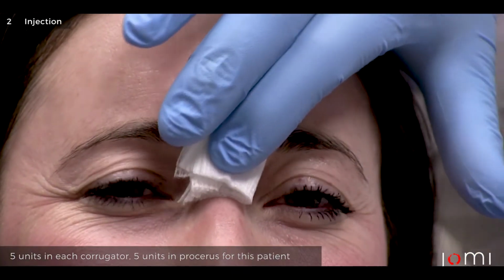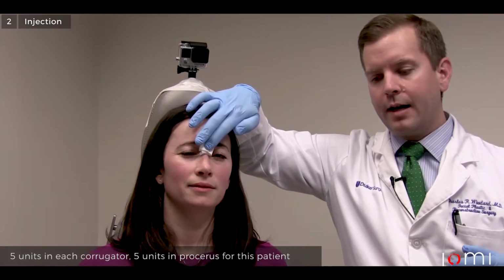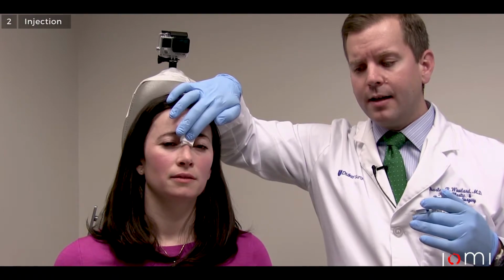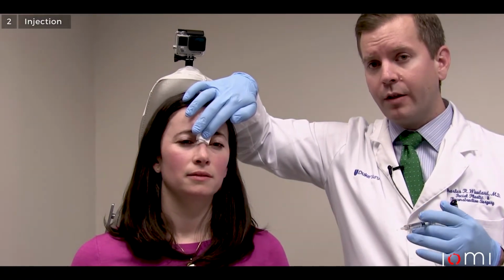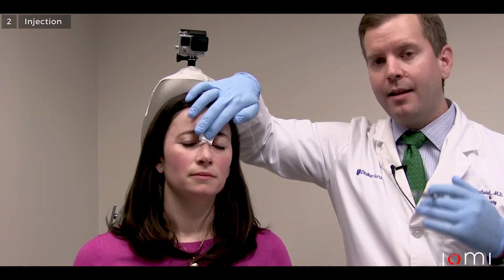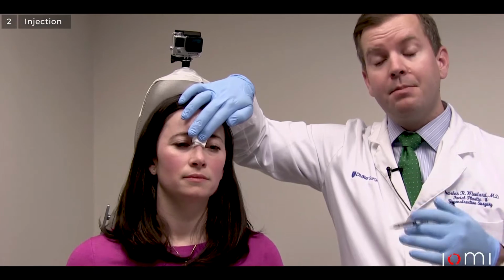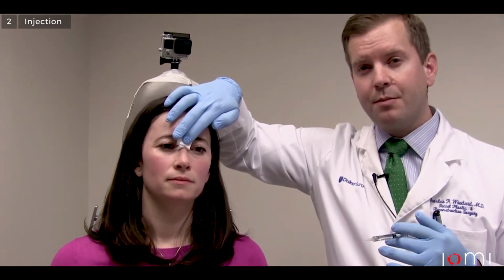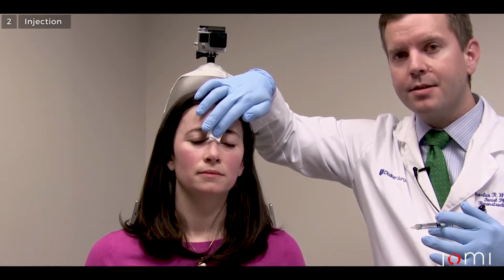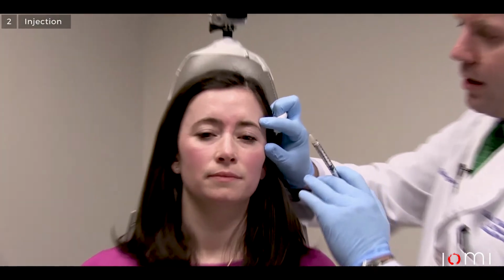All right, so I'll do pressure there for just a second, let her catch her breath, and then we'll treat in the lateral orbicularis oculi region. I tend to do injections in 2.5 unit aliquots on the lateral aspect of the orbit. It's important to remind you that if you are in the orbital skin, deep to the skin you're going to find the muscle. There's no subcutaneous tissue there, so you're going to raise a wheal akin to what you would for a TB test. So you're going to want to try to stay very superficial in the skin when you're addressing the area over here.